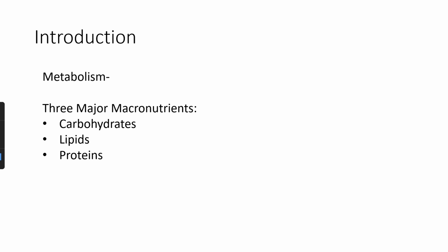Now today, they look a lot different. They used to be these giant tubes, and we used to inoculate the bacteria in all these different tubes and get an arrangement, and then we made them into a smaller and simpler system where we could batch 12 tests in a very small area. And then from there, we made it an even simpler system where now we have automated machines that can detect color changes. So as soon as a bacterium eats something, it can detect that color change and it can report out the metabolic characteristics, the arrangement of tests that would turn positive, and compare that to a bunch of known species, and we can get an identification that way.